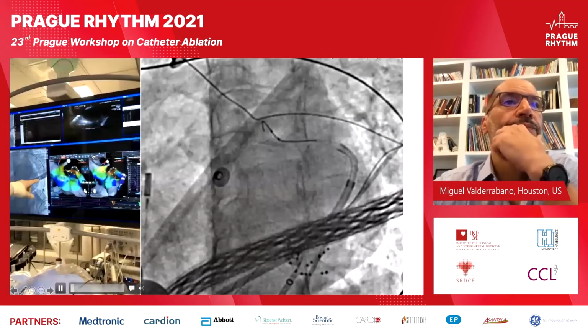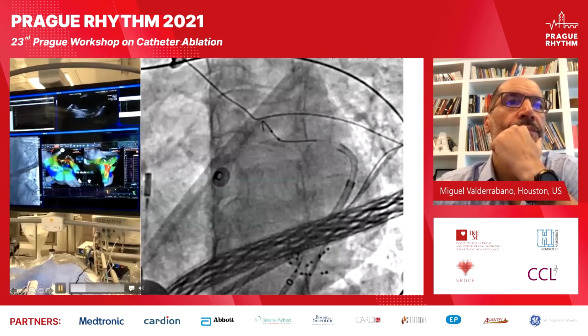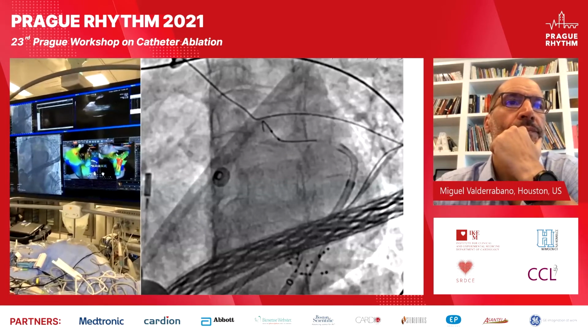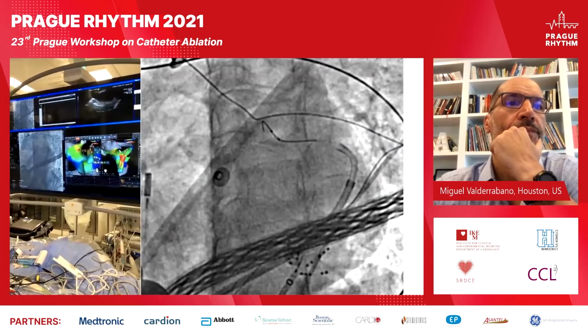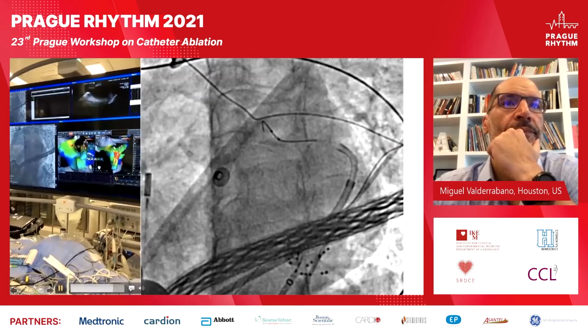Carto tracking the location of the wire by that number 1 is a little bit more medial or septal than where the AIV with the octopolar catheter was. So I don't think I want to take this.